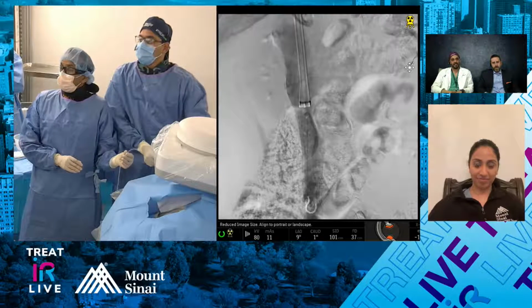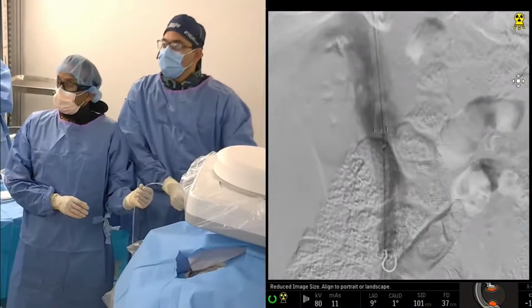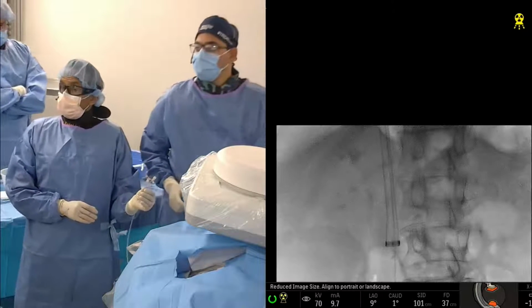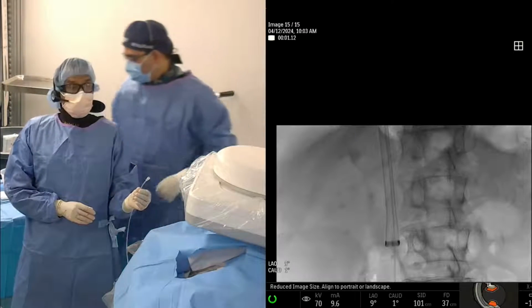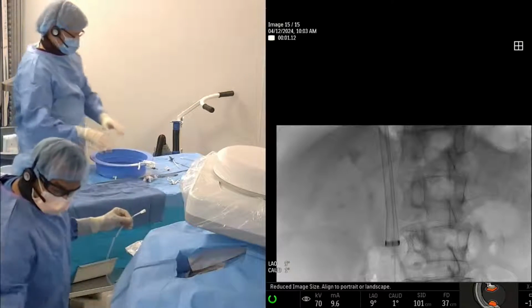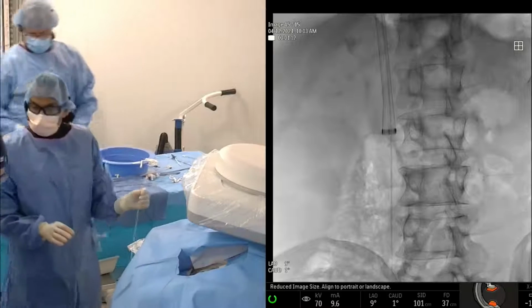Looks good. That's just bad. Yeah, there was a vein there. That's what that was. Yeah. Gorgeous. Looks good. Can we run that again? How do we run it? Okay. Oh, there we go.